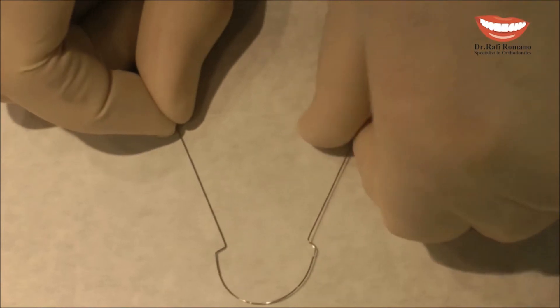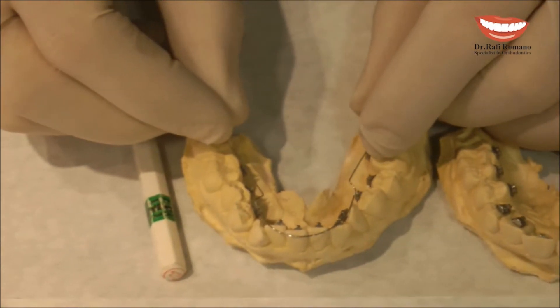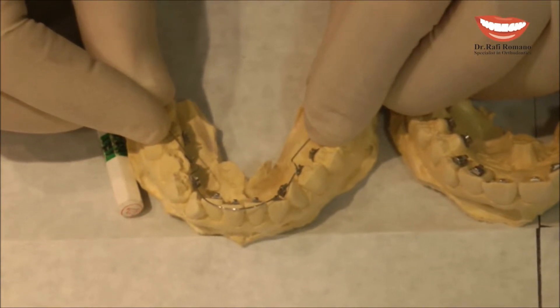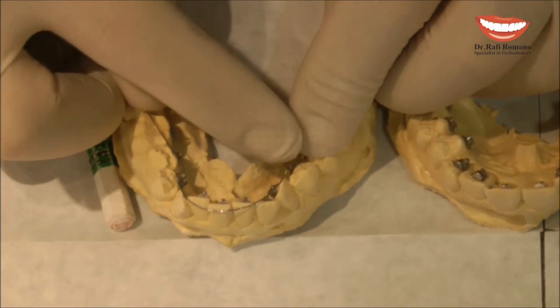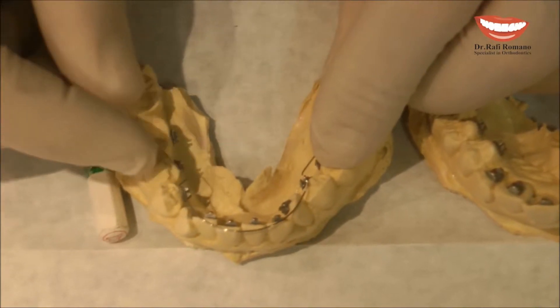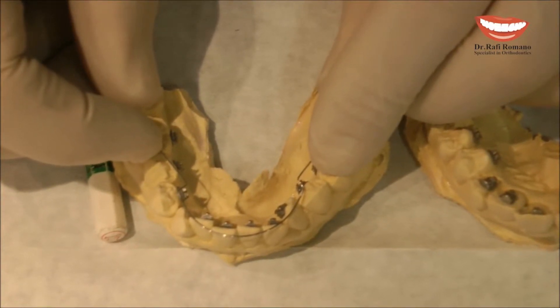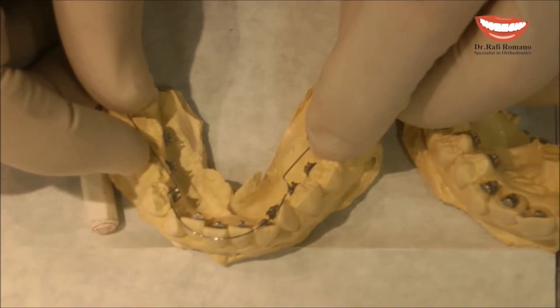But now this is not a passive wire, this is an active wire. Because when you put the wire now — and I have exaggerated a little bit — if you put the wire with the stops mesial to the premolar, as probably I will put in the mouth, you see what happens to the front of the wire. The wire gets the shape of the new position of all the front teeth. The front teeth will be located around the most protruded central incisor. In that way I can get space, because all of them will be aligned on a bigger arch. I will most probably get some side effects.